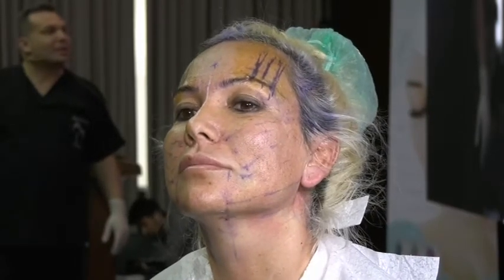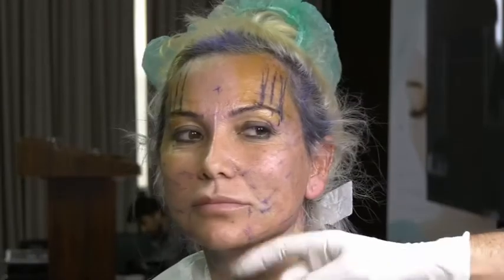Look at the jawline, look at the face profile. Look at the lips. Did we touch the lips? Do you see any change in the lips? What happened? It's lifted up. So if you work in a proper way, you will create a new shape for the face. You will have a very good shape of the face. It's not about just inserting threads. It's about inserting threads in a very anatomical way. We are creating a nice shape. It's not only just to apply threads. Okay, thank you so much.